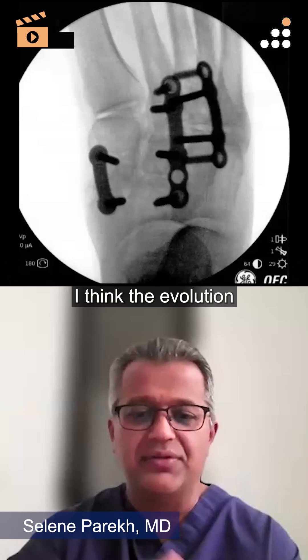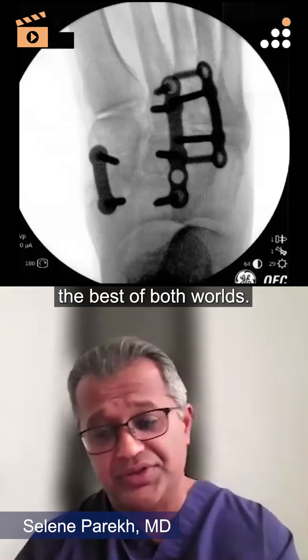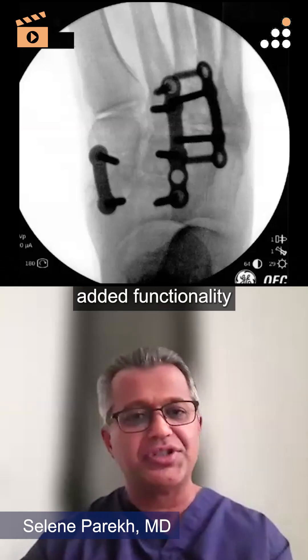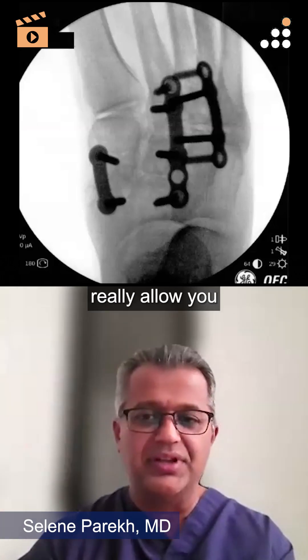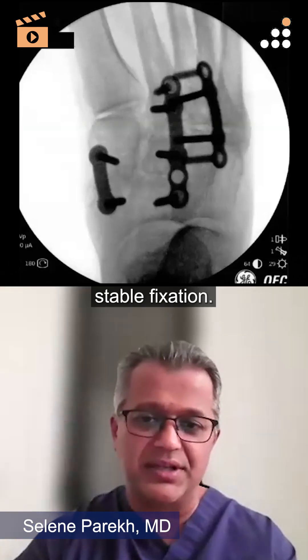I think the evolution of these plates has been great because it's the best of both worlds. You've got great strength, a tremendous amount of compression, and then the added functionality to add these screws distal to the tongs — like you have here — which really allows you to span the architecture and get stable fixation.